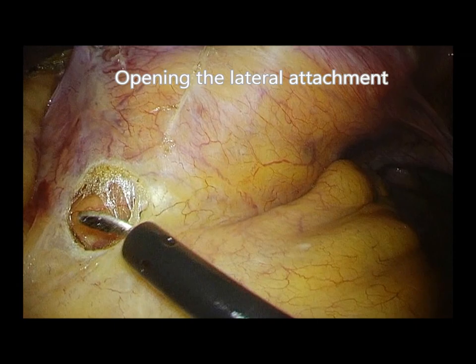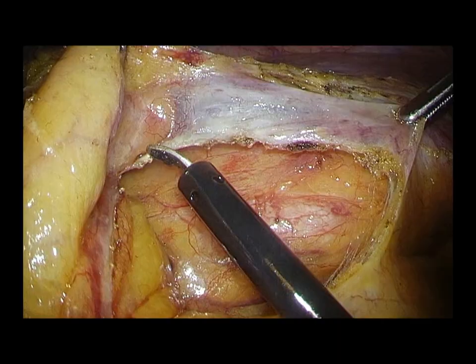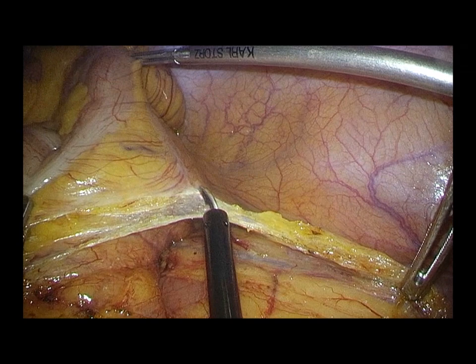Lateral attachment of the left colon is dissected. The left colon is fully mobilized up to the splenic flexure.